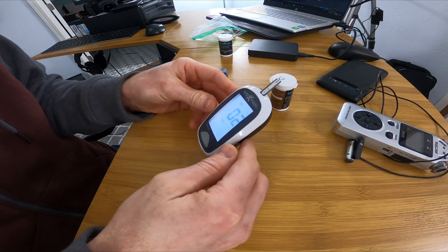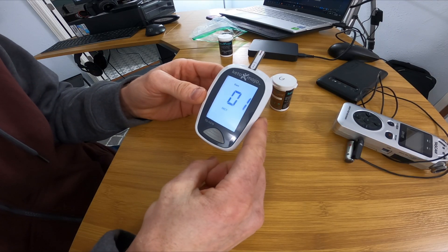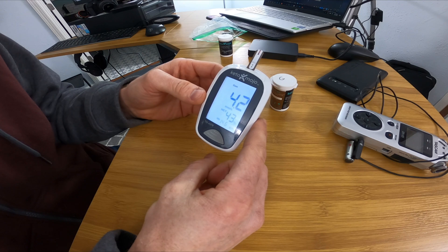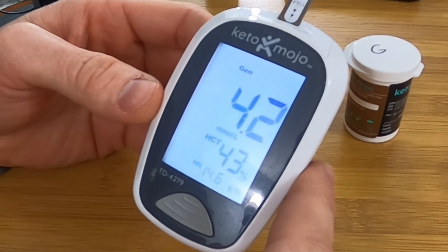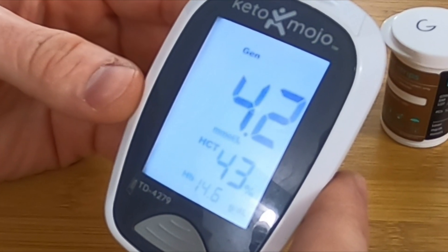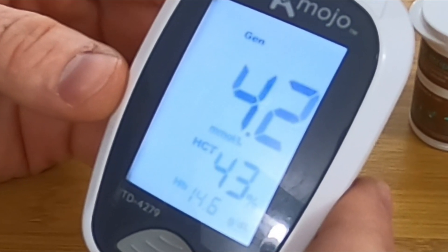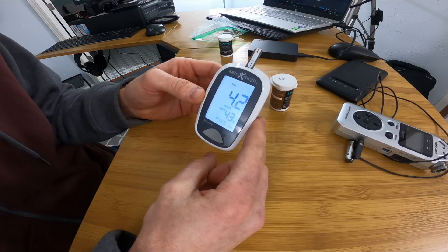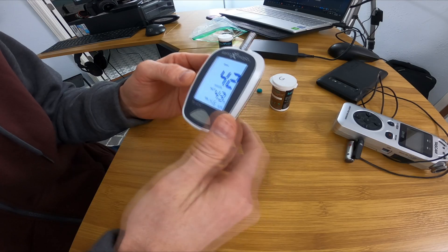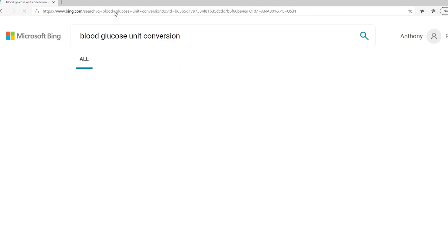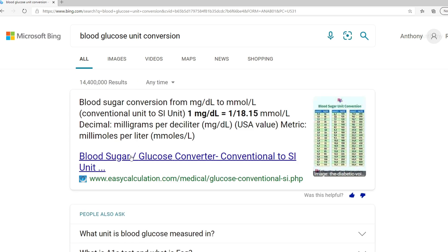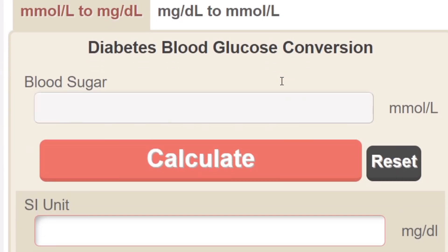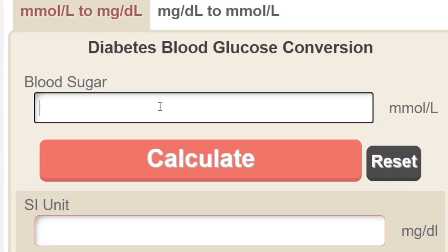Now generally the units will be in milligrams per deciliter, but just to confuse you, I've got it set for the Canadian units here. You can do easy online conversions with those units to figure out what your blood sugar is in milligrams per deciliter.